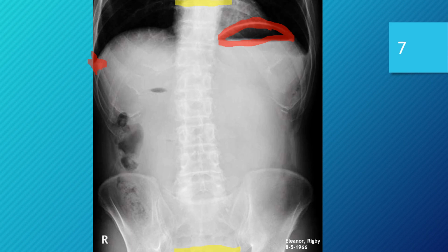So moving on to number 2, is the anatomy properly positioned? We'll get our midline here. Whoa. So I changed to a different computer, and I'm getting used to the movement here for this cursor.